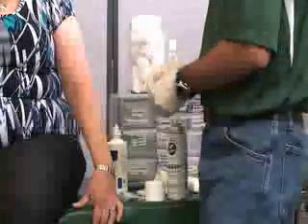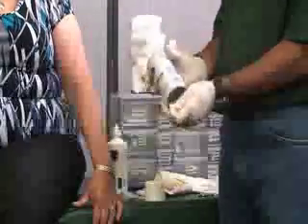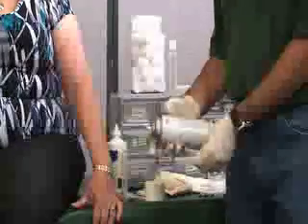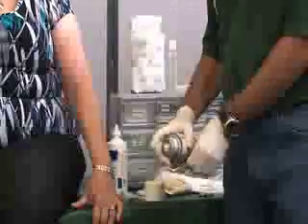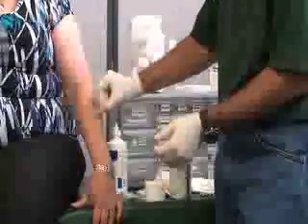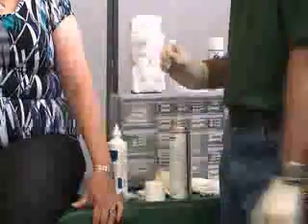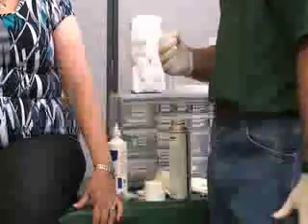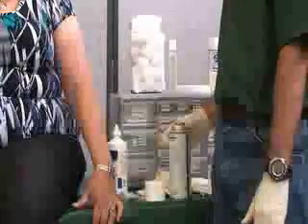Another technique we can use if we don't have the Stick-It ampoules is something called Tough Skin, or something similar applied with a cotton tip applicator. With this one, we spray it onto the top of the cotton tip applicator, then apply it to the edges — a few millimeters away from the wound — because that area is where you would attach the base of the Steri-Strip and the bandage.